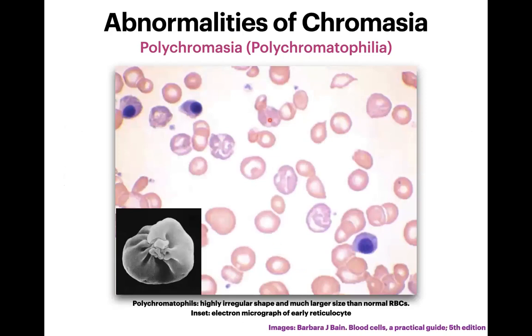This image is from a case of sickle cell anemia in acute hemolytic crisis. You can see very irregularly shaped polychromatophilic cells, corresponding to the electron micrograph of an immature reticulocyte. Some NRBCs are also present. These polychromatophils are almost two to three times larger than normal RBCs with very irregular shapes.